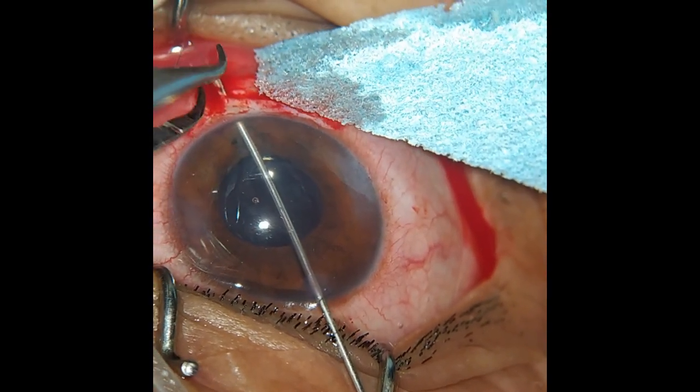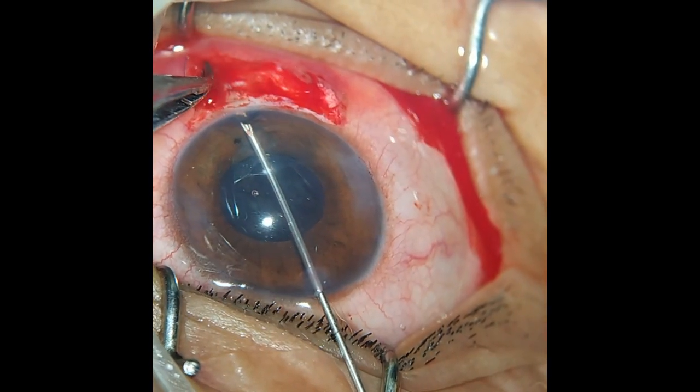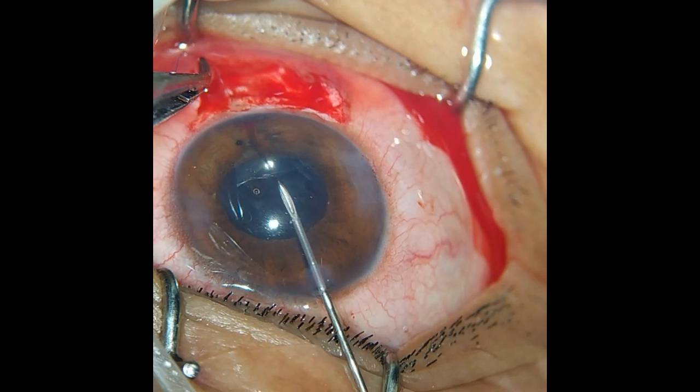The suture at the needle tip is held with a tying forceps and the needle is retracted into the AC.